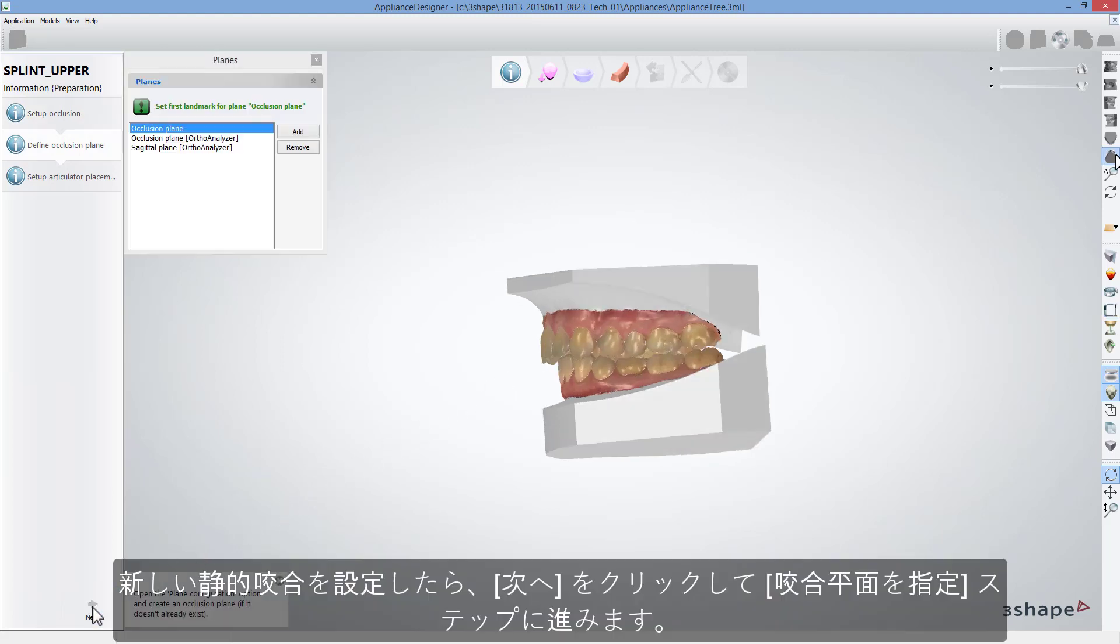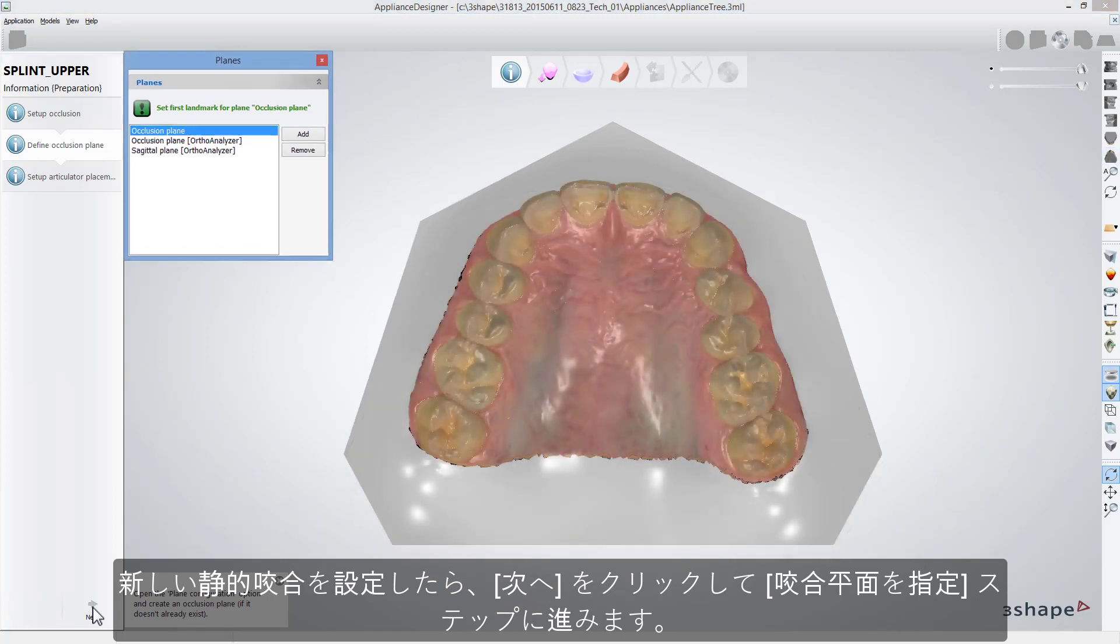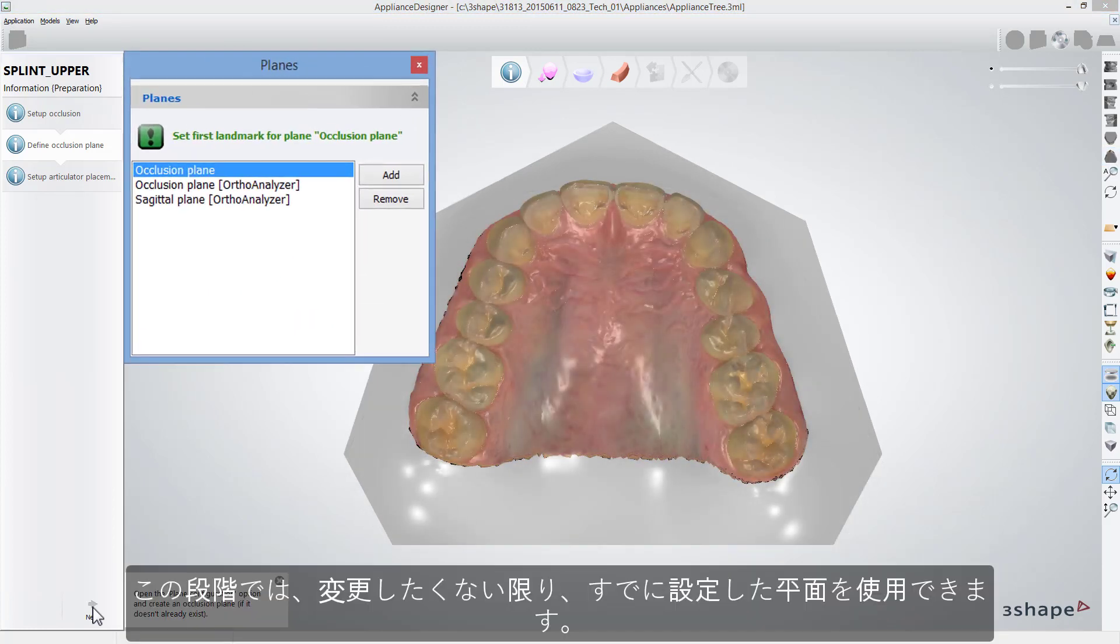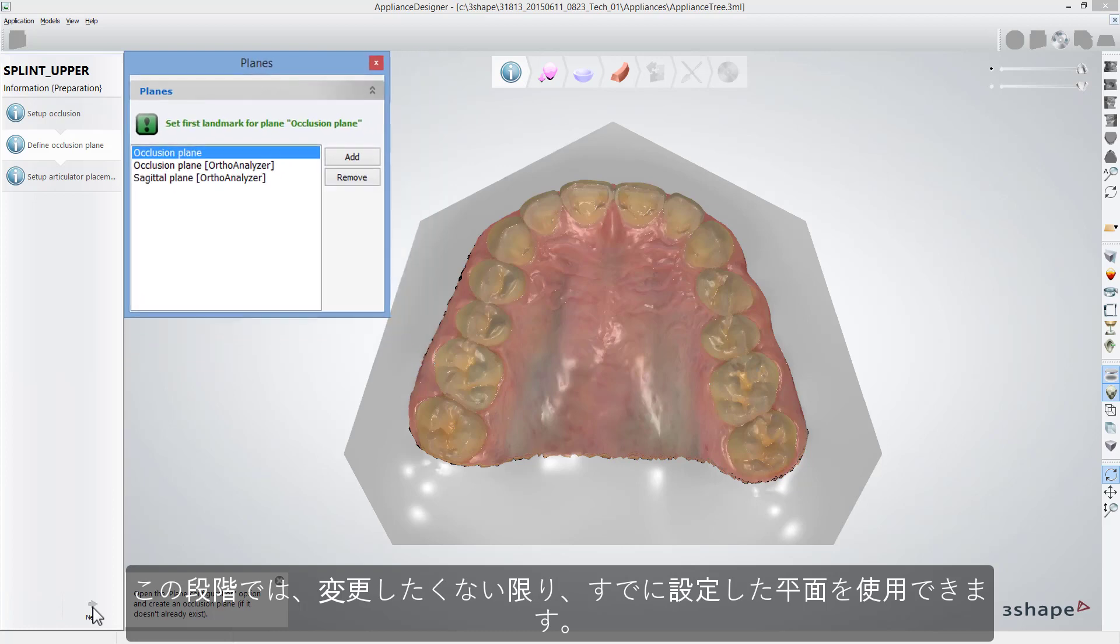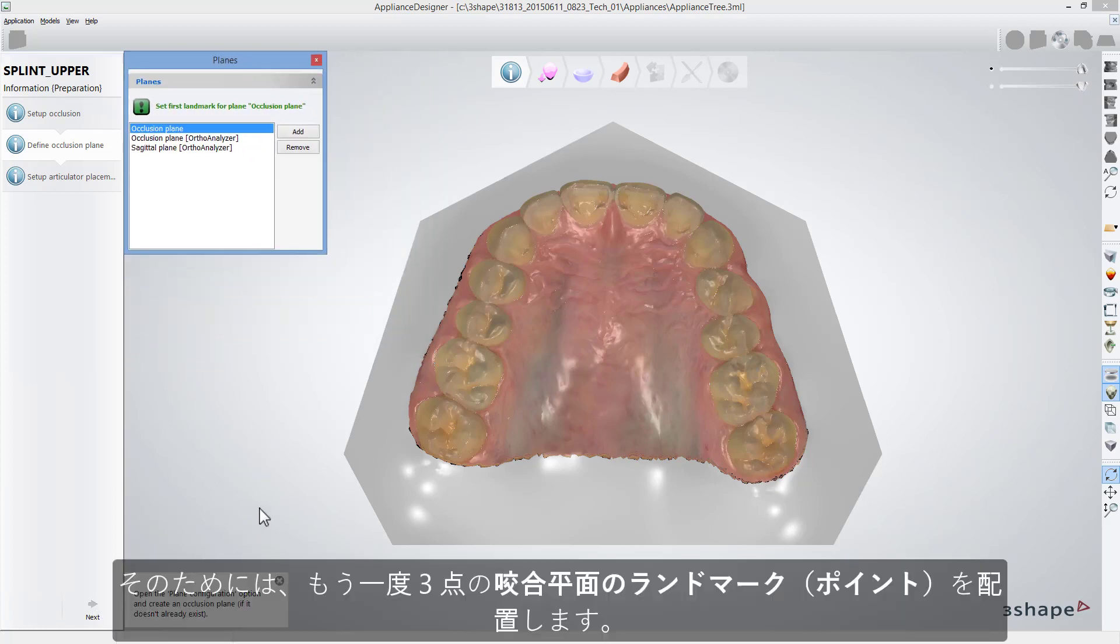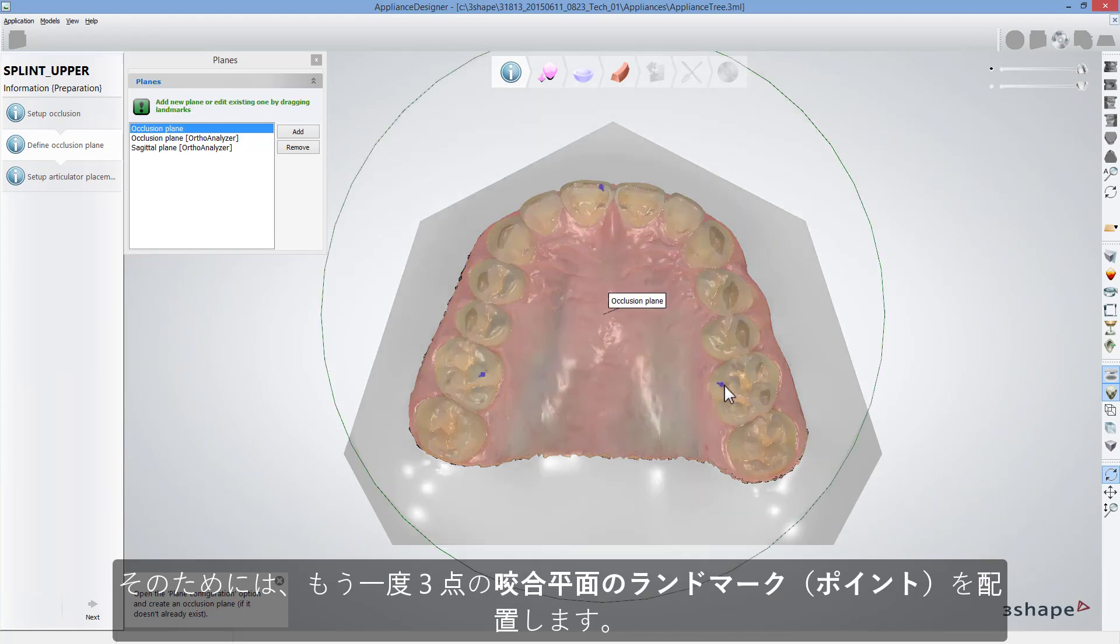Once you have set a new static occlusion, click Next to get to the Define Occlusion Plane step. At that stage, you can use the plane you have already set unless you would like to change it. To do that, place three occlusal plane landmark points once again.